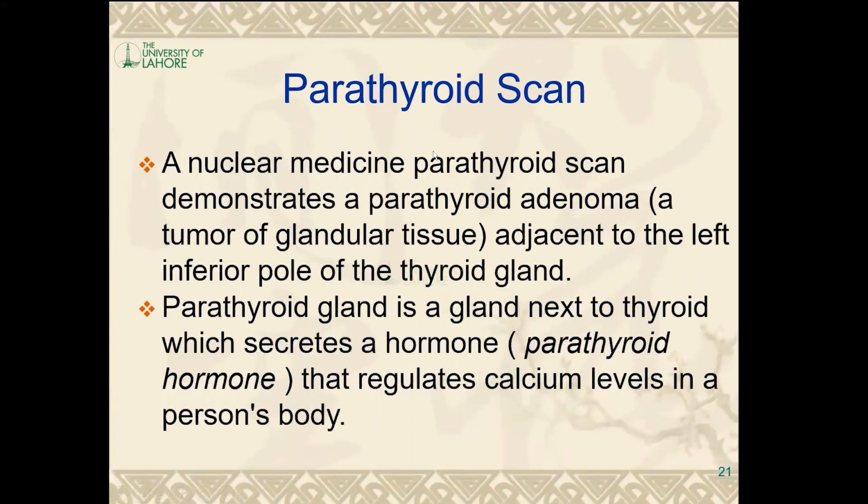Another application of nuclear medicine is in parathyroid scan. Basically, a nuclear medicine parathyroid scan demonstrates a parathyroid adenoma. Basically, in your neck you can see the thyroid gland, and the purpose of the parathyroid glands is to regulate calcium levels in the person's body.